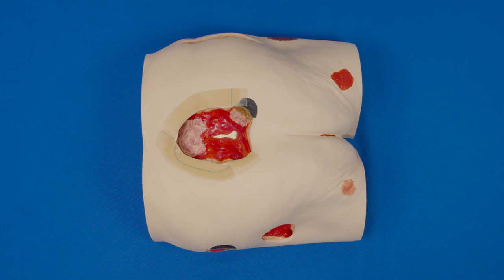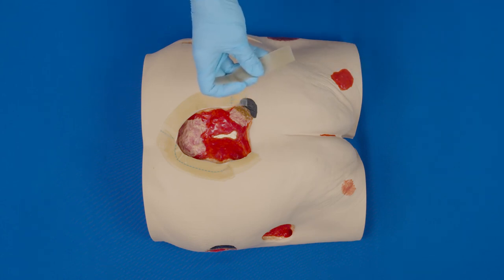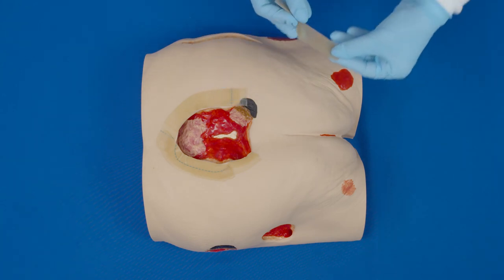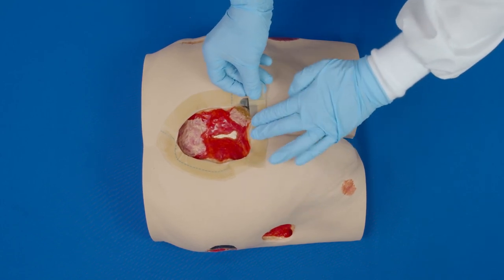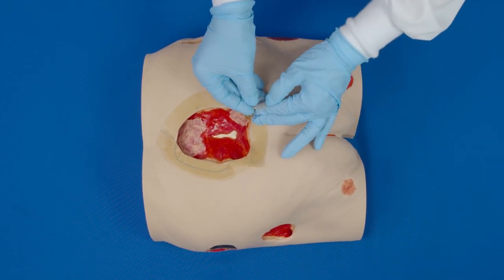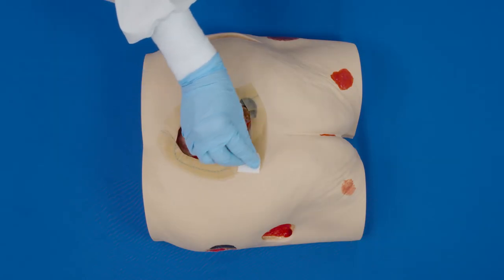Hydrocolloid is also very helpful in assisting with a hard-to-seal wound dressing. The hydrocolloid will absorb some moisture, so it is a great option in moist areas such as the groin, a foot, or perineal wounds. Cut the hydrocolloid in strips about one to three centimeters wide and picture frame your wound with the strips.